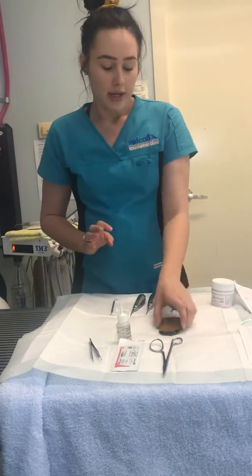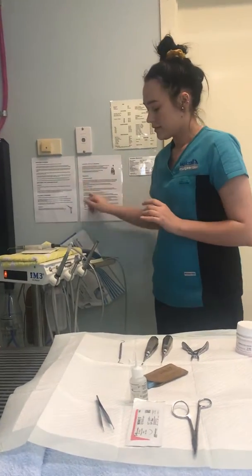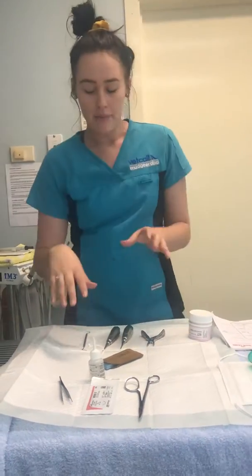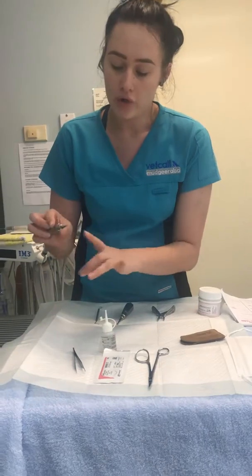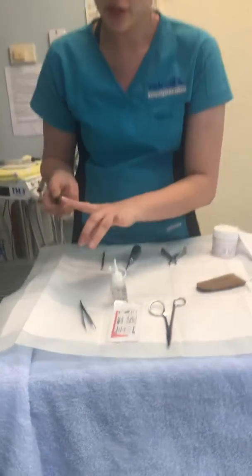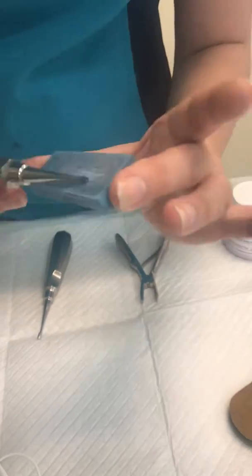Now in terms of maintenance and sharpening of these instruments, you've got on the back here all of the maintenance required for this IM3 machine, as well as the instruments. Now in terms of sharpening, you do have this sharpening block. The way to do that is you just hold it in your hand with your middle finger and your thumb, only sharpening the back of the instrument there, so you're not creating any sharp edges. So all you do is just find it there and then move the one with your block. Same for the other side.